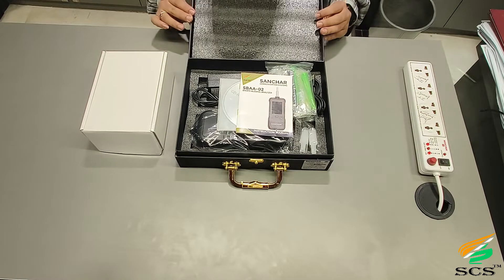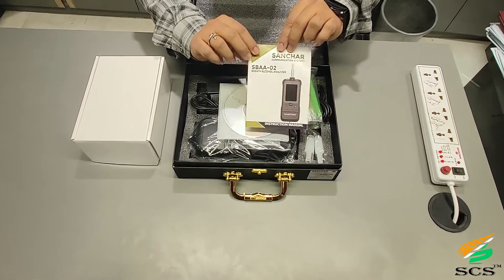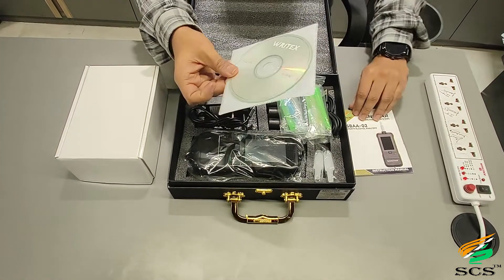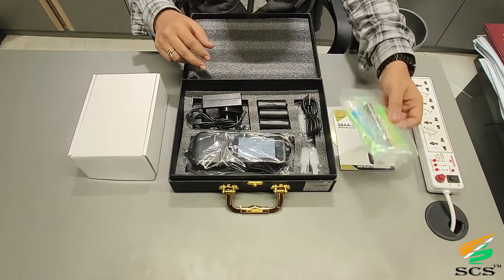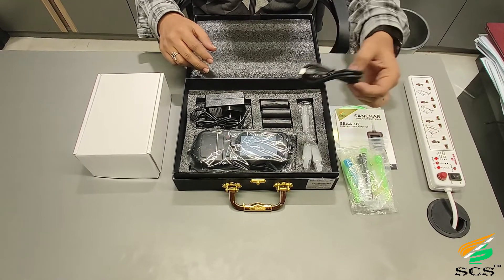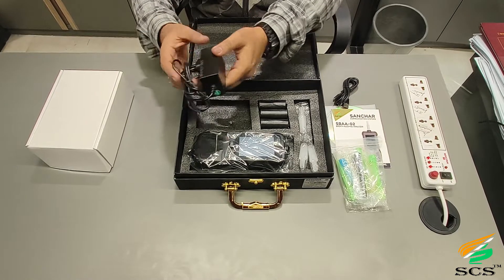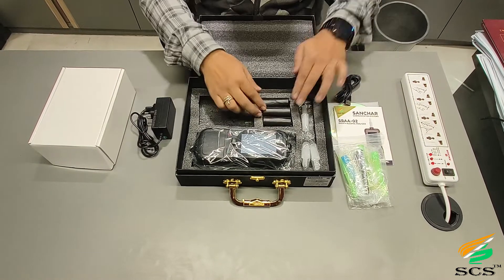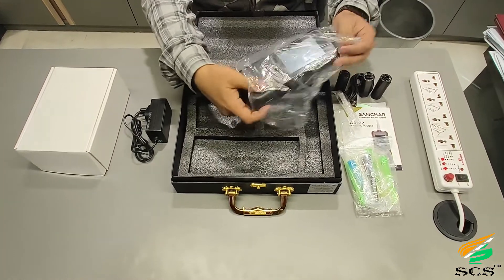In the box you will find: the user manual, software CD, extra disposable mouthpieces for active testing, USB cable, power adapter, thermal printer, thermal roll, and the SBAA 02 breath alcohol analyzer itself.